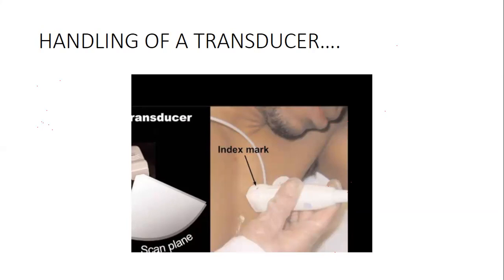The apex becomes closer, just around the nipple, around the third to fourth intercostal spaces. You find that the apex will be somewhere there, but make sure the pointer or the index is pointing to the right shoulder. That's when you can pick some images that are meaningful. So make sure that the pointer is well oriented, and then orient yourself to the expected cardiac structures that are given.